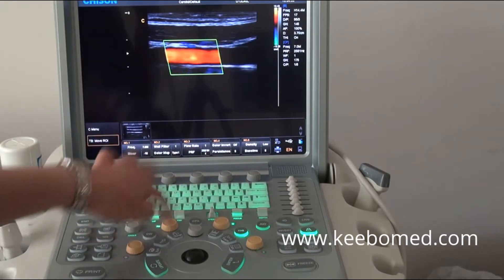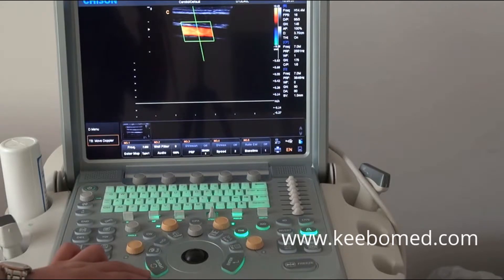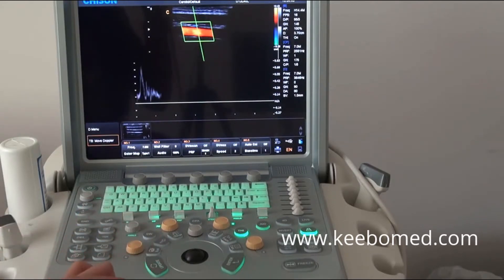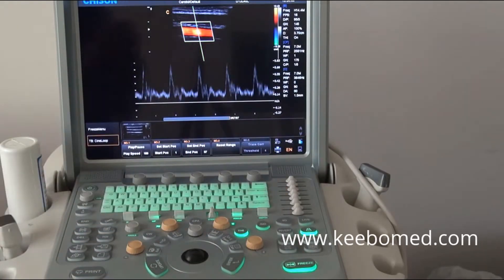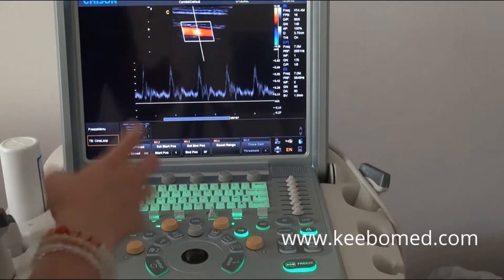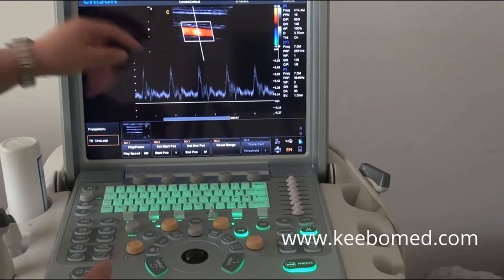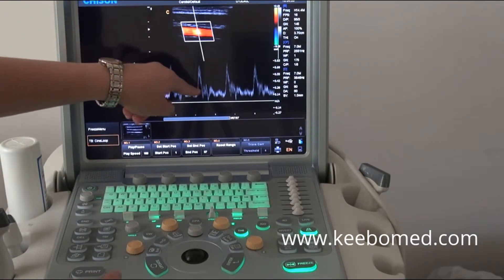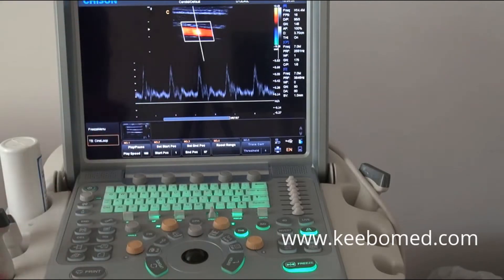After that, we go into PW mode. You can find that this spectrum is very sharp, the background has no noise, and the spectrum window displays very well — it's very clear.